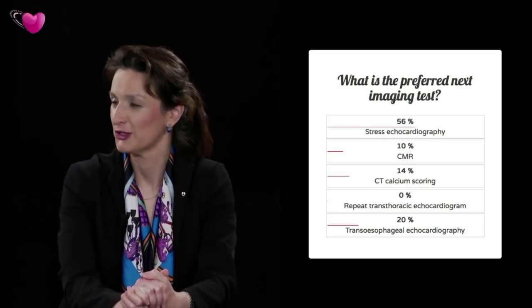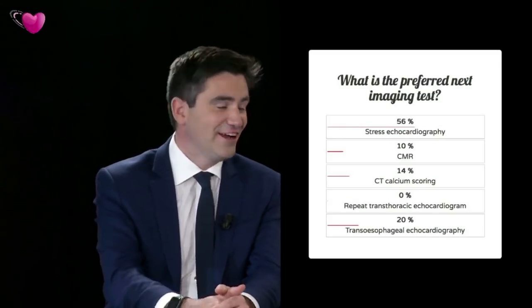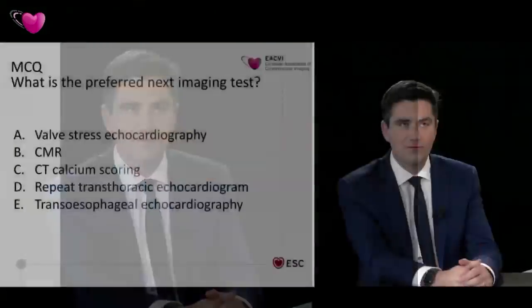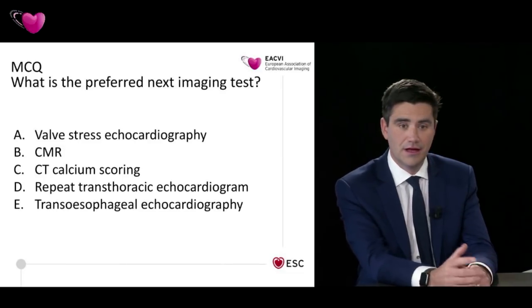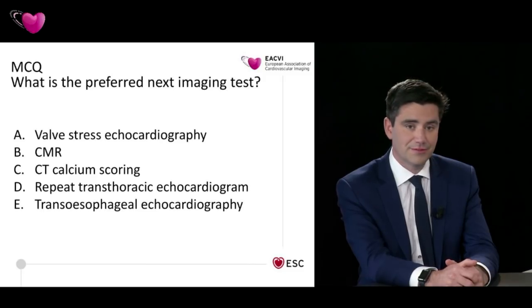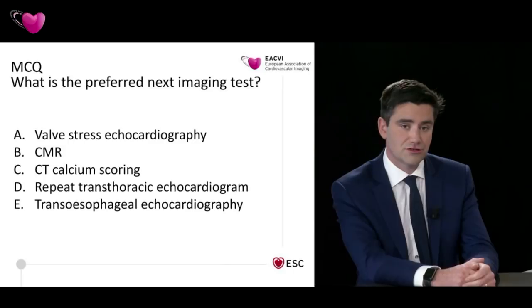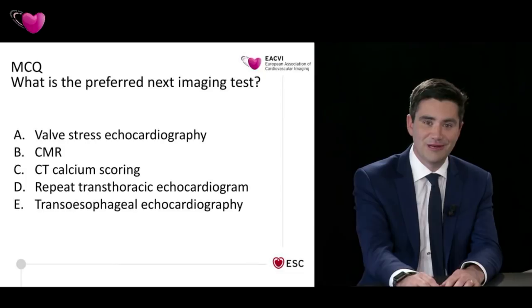What did you do? So it looks like I'm a lone voice here, but we didn't go for any of those. We went for an MRI scan. And I guess stress echocardiography was right at the top of the list of things we wanted to do. But we were a bit concerned about the non-sustained VT on the monitor that we captured, and we were concerned about giving this lady dobutamine stress. So we elected to do an MRI scan, and I'll show you the pictures.